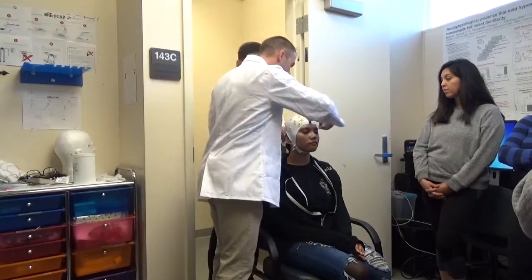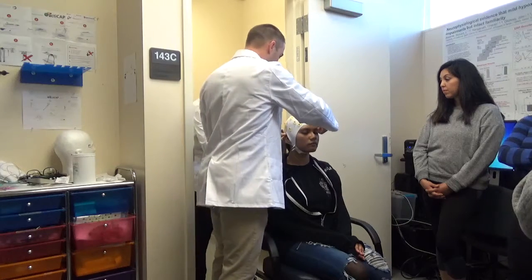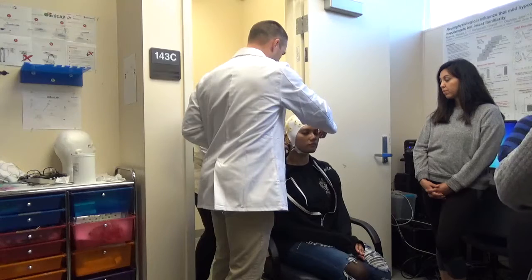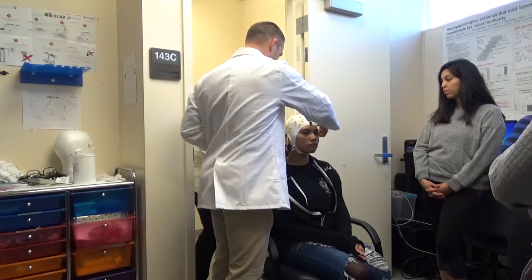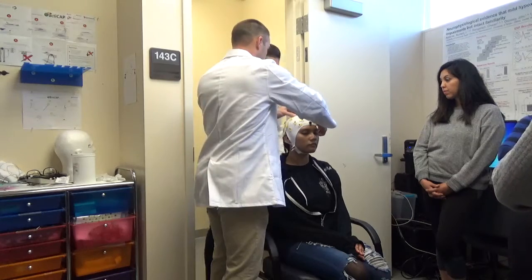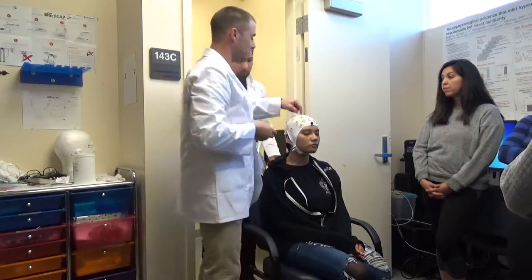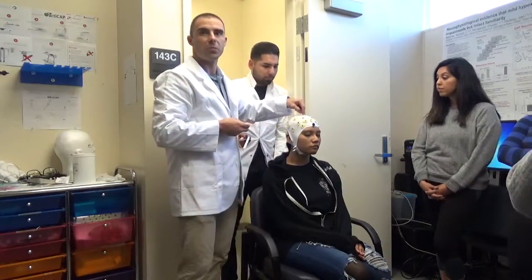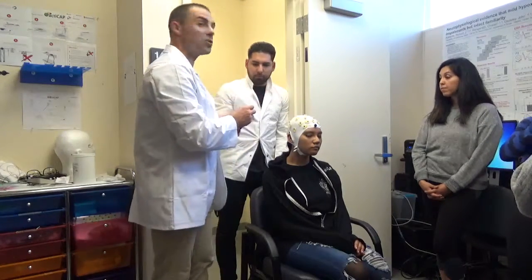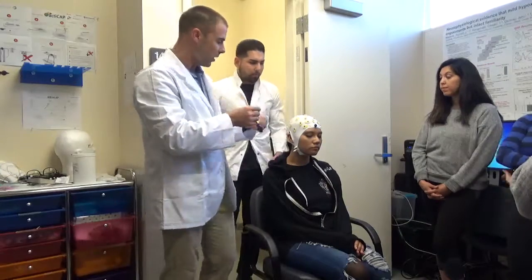And then from the top of the ear to the other ear, where's that? To the bottom ear? Top of the ear. Top of the ear. 12 and a half. 12 and a half. Okay, that's perfect. So right about 6 and a half, 6 and a quarter there. So this is our central electrode, and that should be your middle point for those measurements. And if it's off, then you'll see that we just readjust. Okay.